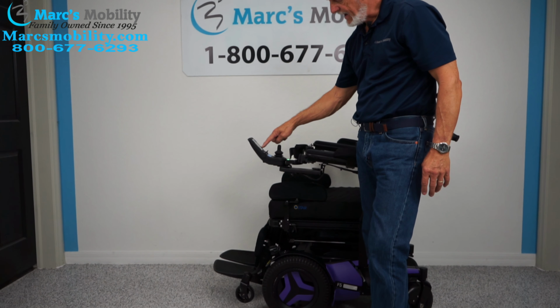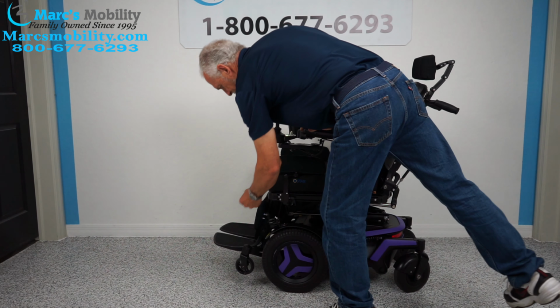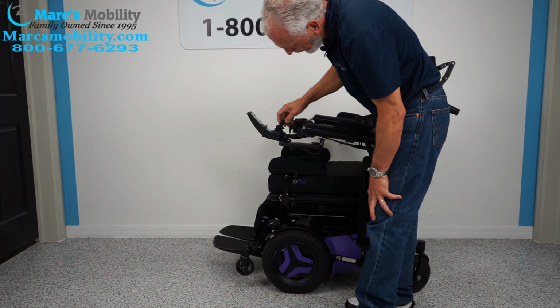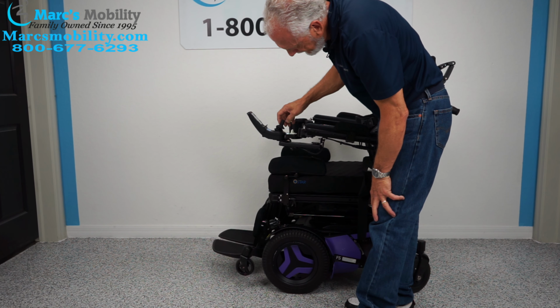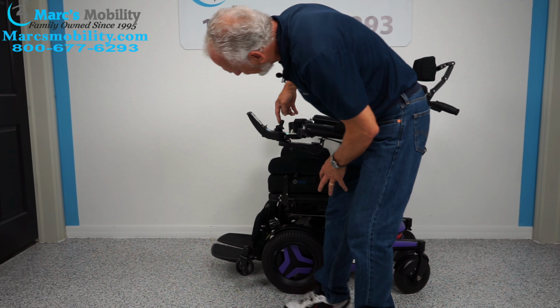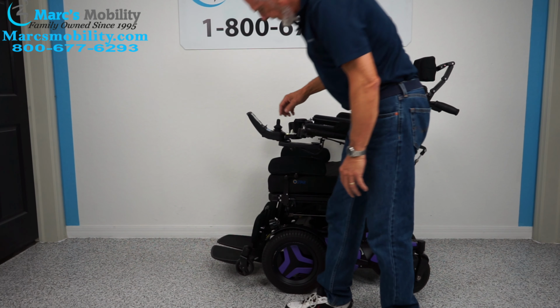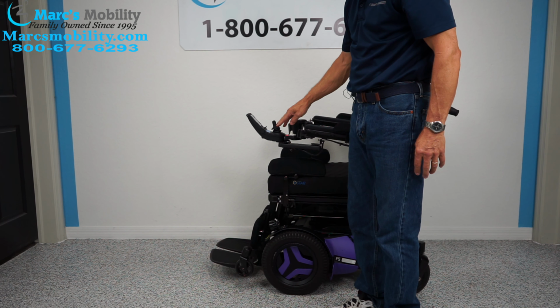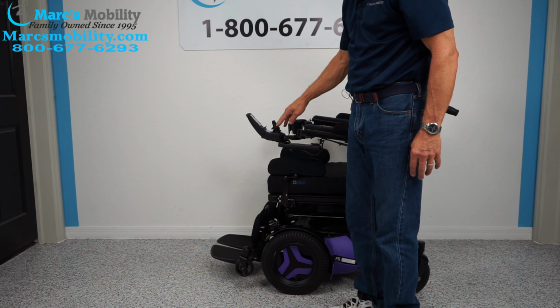So now I've got a set of arrows right below the feet. So if I do it now, watch the feet. See how they're going down? And that's what that little motor I was showing you earlier right here does, okay? So that's your 7th electrical function. And this brings it back up.